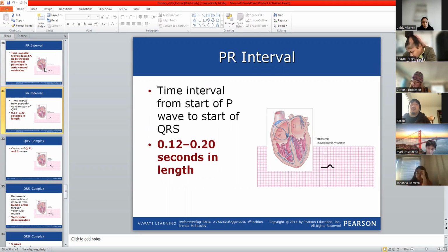So what is the normal time, Aaron? Let's see. It's around... point 6? 0.06? Do you hear me? I hear you, but you don't answer my question. You asked how much time is between... I thought it was intervals? 0.4.